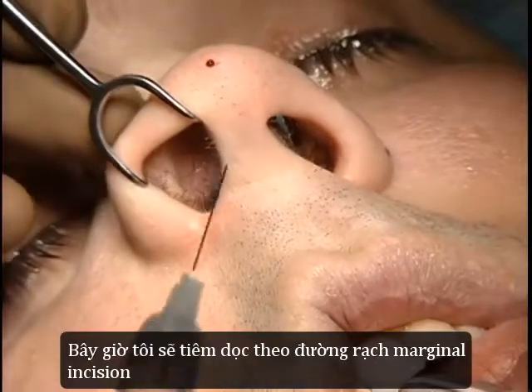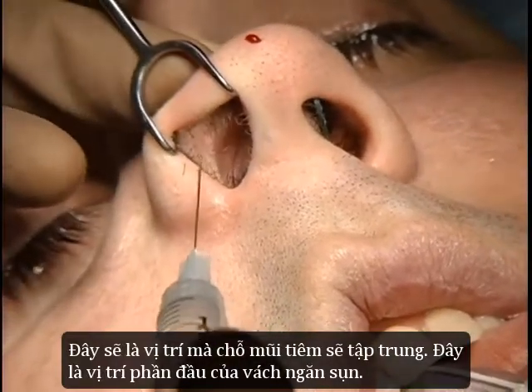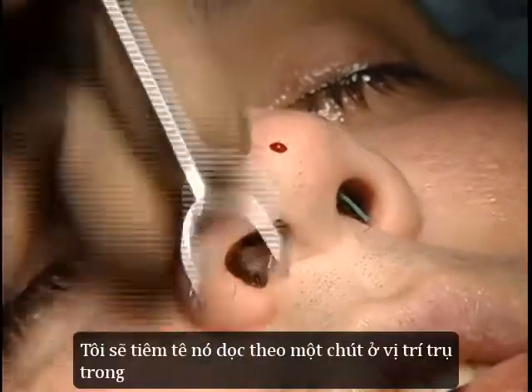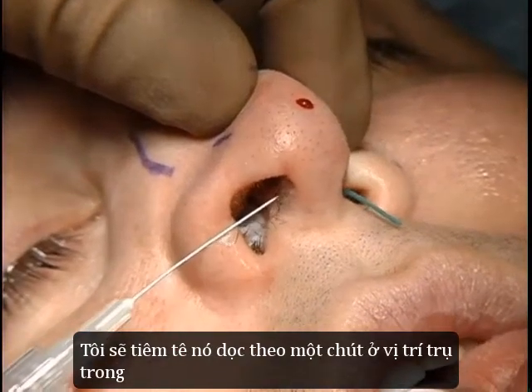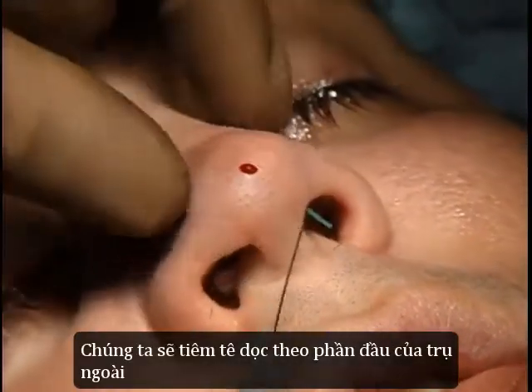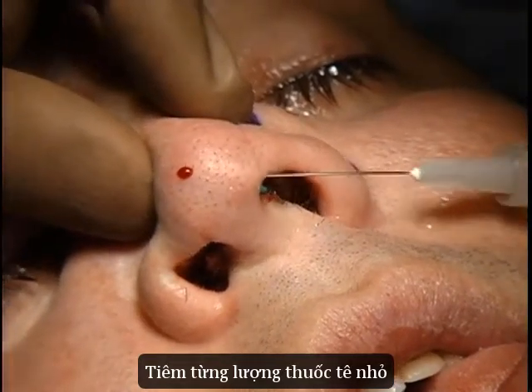Okay, so now we're going to inject the marginal incisions. You can see this area here is where the injection is going to be deposited. This is the caudal aspect of the cartilage there, so I'm going to place a little bit of local anesthetic right into that area, right along the positioning of my marginal incision. I'm going to do this all the way around. Deposit a little bit right over the medial crus. Similar injection on the opposite side, right where we're placing our incision just along the caudal aspect of the lateral crus. Just multiple deposits of local anesthetic.